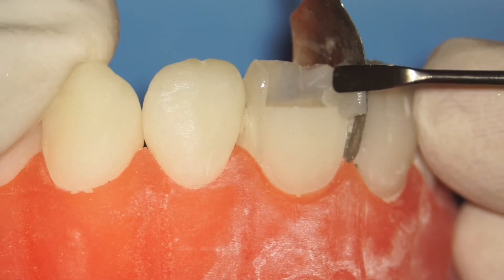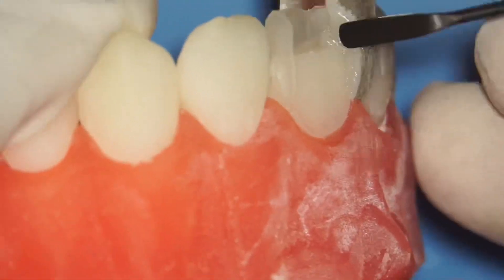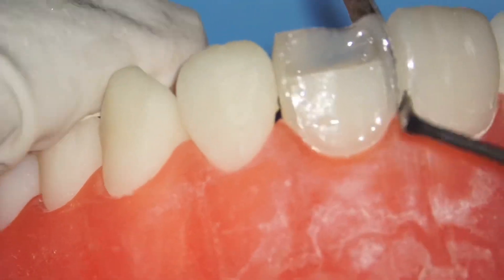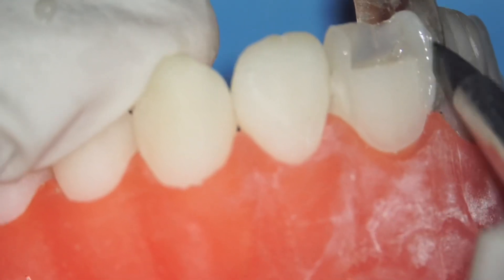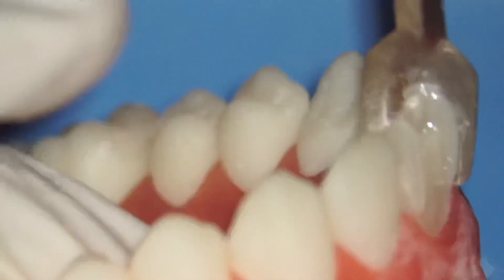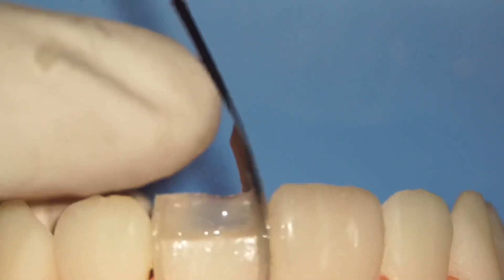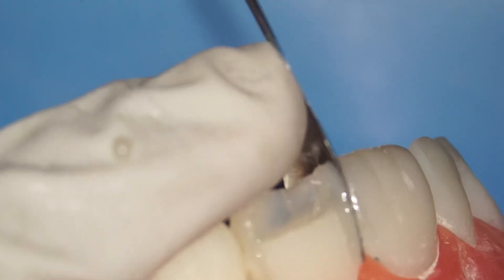Continue the same process on the mesial side — slowly start packing composite. Curve it in slightly at the cervical and at the incisal so you have a smooth curvature, with the middle being the thickest part. I'll hold the matrix to make the wall straighter, and use a silicone brush to smooth everything out. Then use my finger to push the matrix so the wall is more straight, because the mesial wall is always straighter than the distal wall.